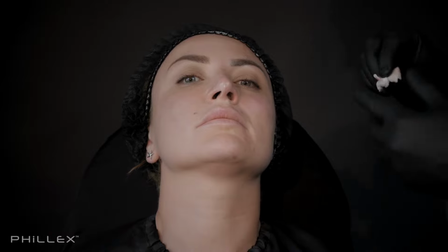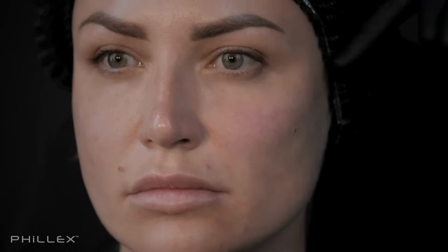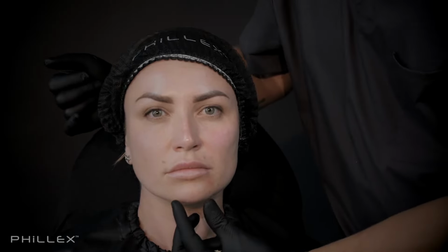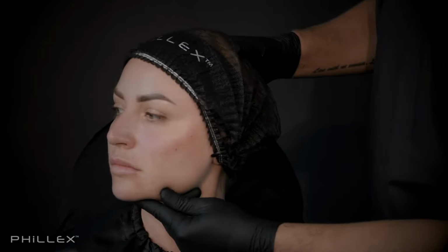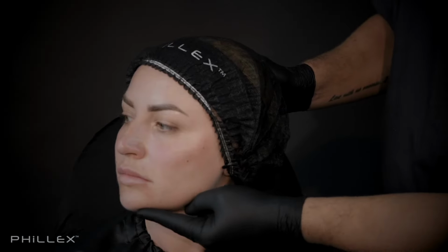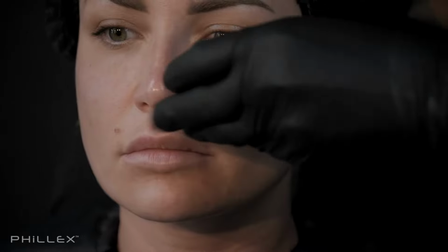Super. So, let us analyze what we have on this half of the face. We have a more prominent and higher cheekbone. You see the difference with the previous side. We have light changes of the chin, a little bit elongated and a little bit prominent. Please look how the ogee line has changed. The cheekbone goes up. And we have a delicate, probably ideal nose. And now I will inject till the end of the line, and after that we will see the final result.